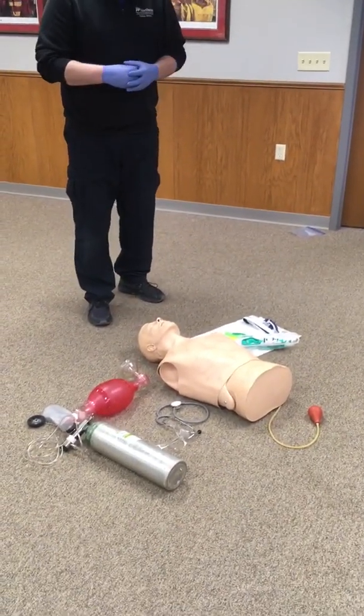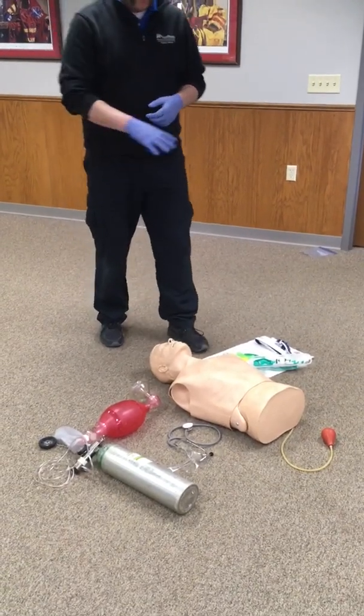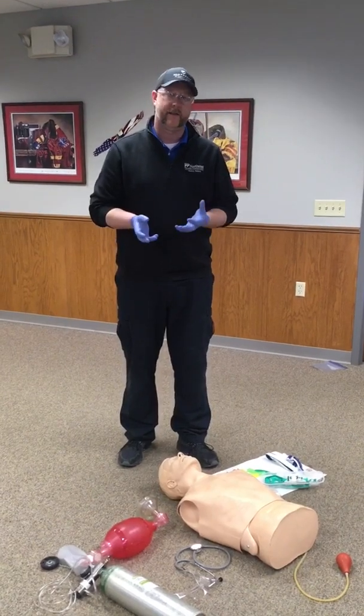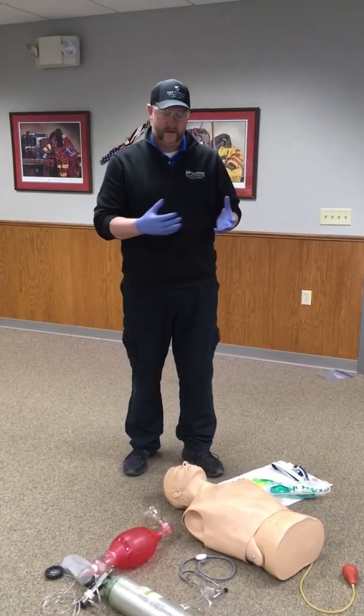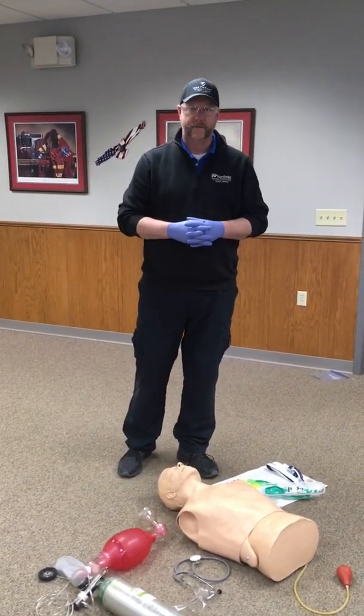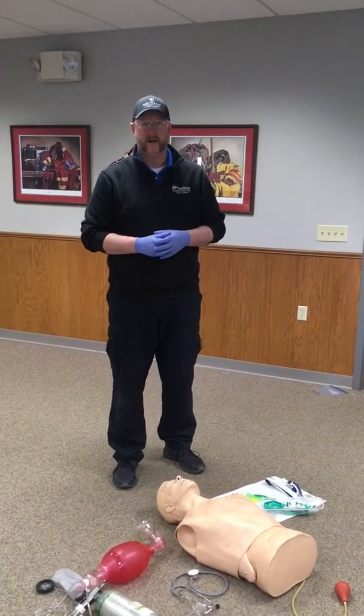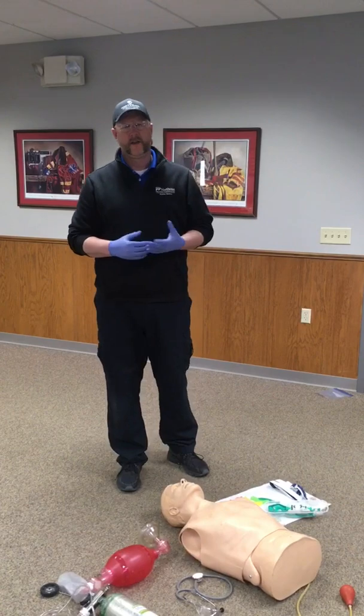Once you come into the station, they're going to give you a moment to look over the equipment, so feel free to go ahead and test out the equipment and make sure that everything you have is going to work when you go through the station. As we get ready to start, once you let the examiner know that you're ready, they're going to give you a scenario.